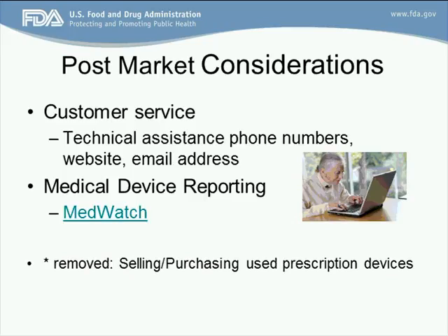And finally, there's the post-market considerations. You should have a customer service number. I think almost everybody has one. But we did have to have that in the guidance here, and some sort of technical assistance phone number or a website or an email address, some way that somebody can get in touch with somebody and get their questions answered as they're trying to operate their device, especially on weekends when they feel so alone anyway and there's typically no medical assistance available.